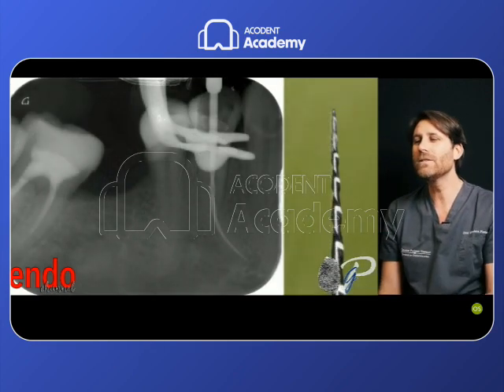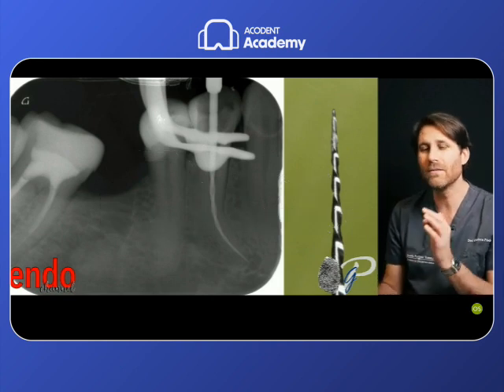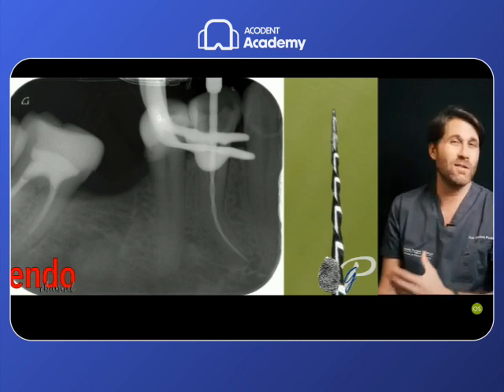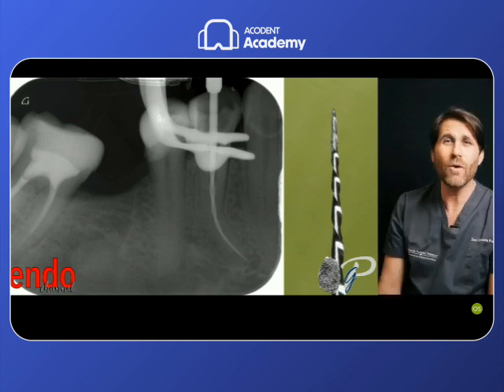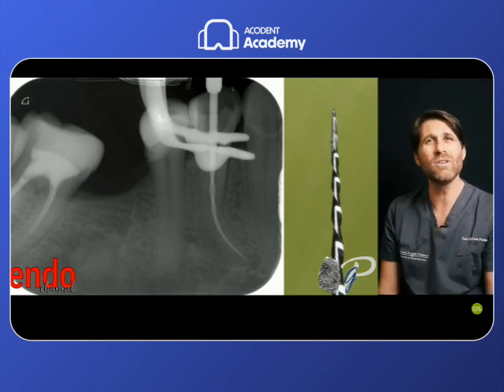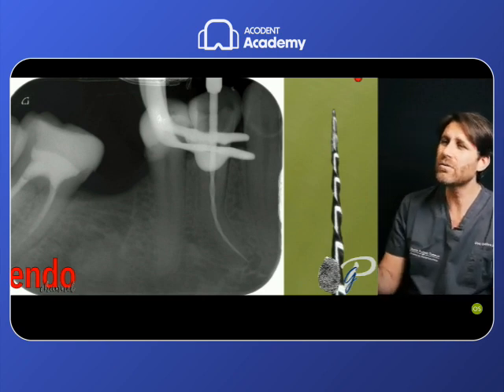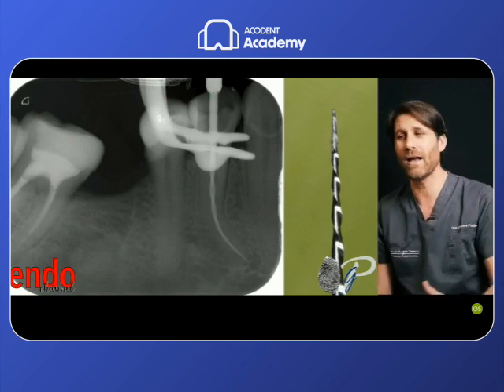And we very slowly reach the working length, cutting this type of dentin, a very small amount of dentin, penetrating very slowly. Probably we need 2 or 3 new files to do this technique because we apply a very big effort, very big power action on the tip of the file to cut this really constricted root dentin, the really hard reactionary dentin. But the instrument, as you can see by this radiograph, follows the path of least resistance given by the root canal and the reactionary dentin.